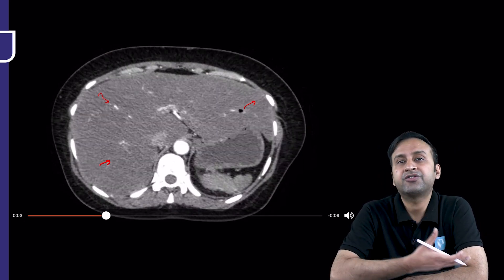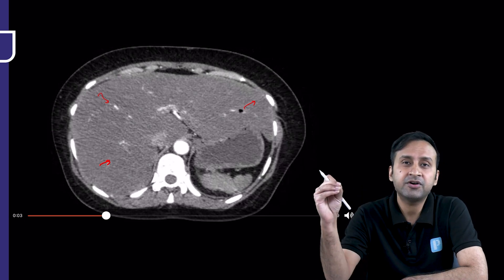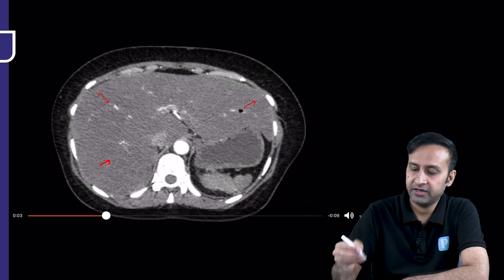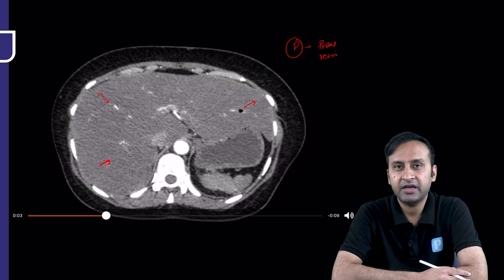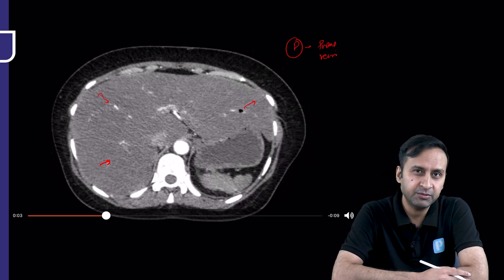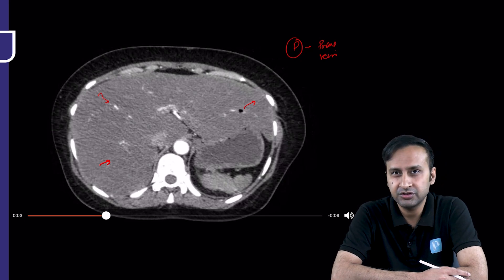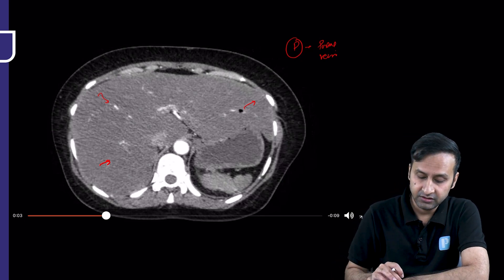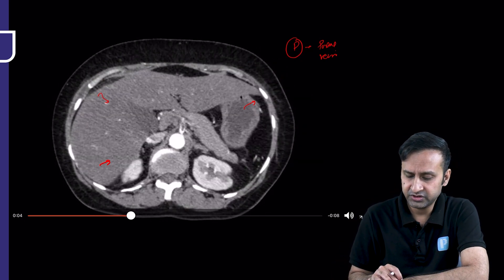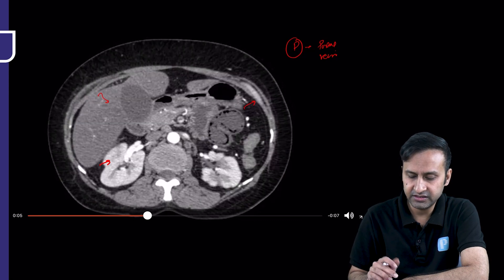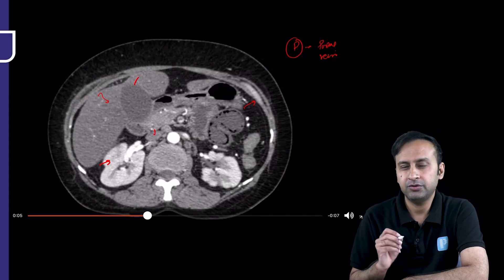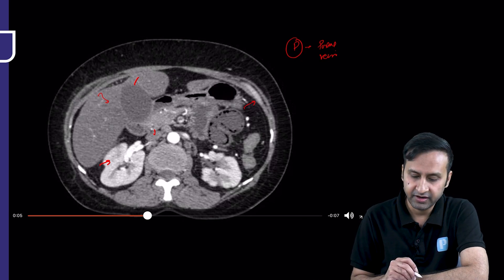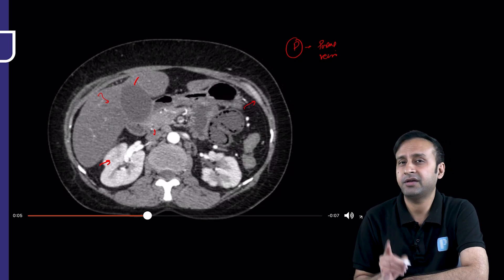How do we differentiate portal venous gas from pneumobilia? Pneumobilia is more central — if you find air specks in a peripheral location, it is more likely to be portal vein gas: 'P for peripheral, P for portal vein gas.' Secondly, in pneumobilia, the patient would have a history of some intervention, or you might see air in the gallbladder fossa. This patient had no such history; the entire CBD and gallbladder looked clean. So there was no confusion — we knew we were dealing with portal venous gas.